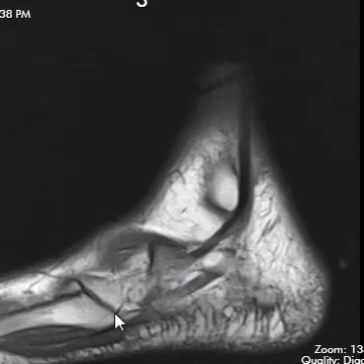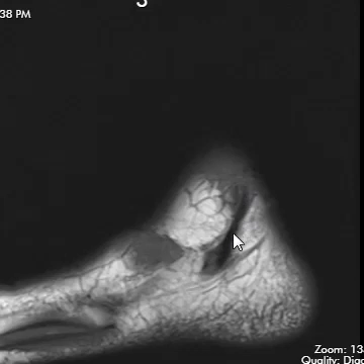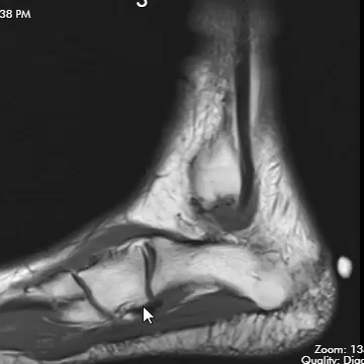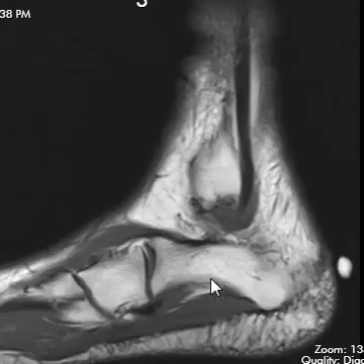It looked pretty good but we lost it between here and here. The question was: is this magic angle phenomenon? Is that why it's absent, or is it torn or tendinopathic? Same with the peroneus longus tendon — it comes down to the peroneal tubercle, loops behind that, and between here and the cuboid bone where it goes beneath, it is not well seen. In this region you can also have something called a fibrocartilaginous node, so the question was whether that's what it is or magic angle phenomena. We just don't know.